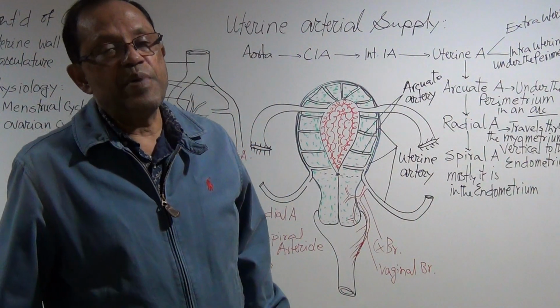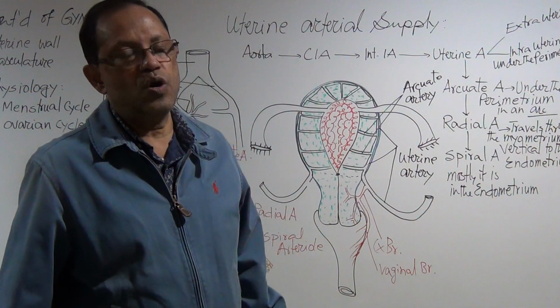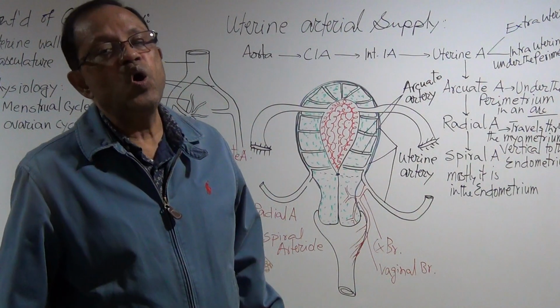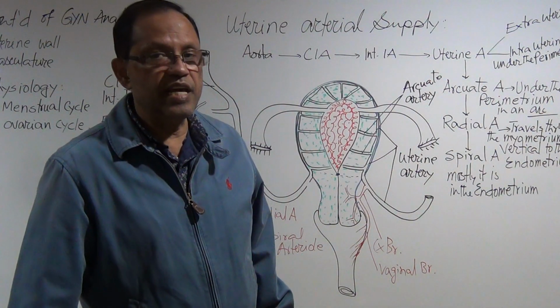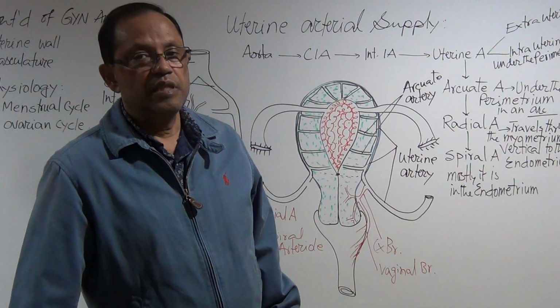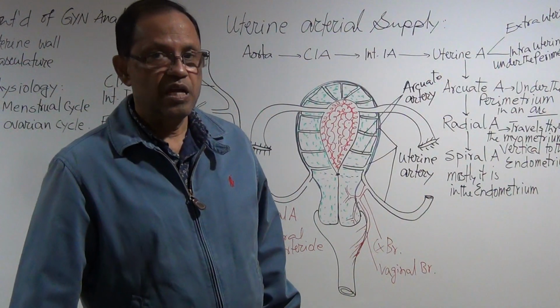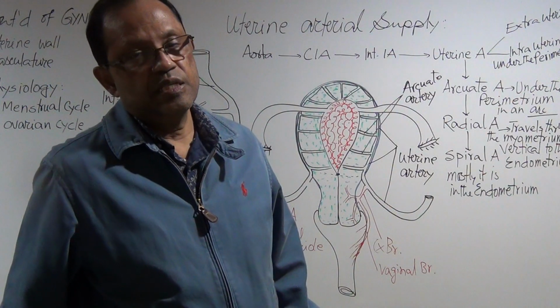When there is some pathology, suspicious infection or malignancies, then you can see the lymph nodes close to the internal iliac artery and vein. There are multiple lymph nodes enlarged, and the inguinal group of lymph nodes are enlarged.